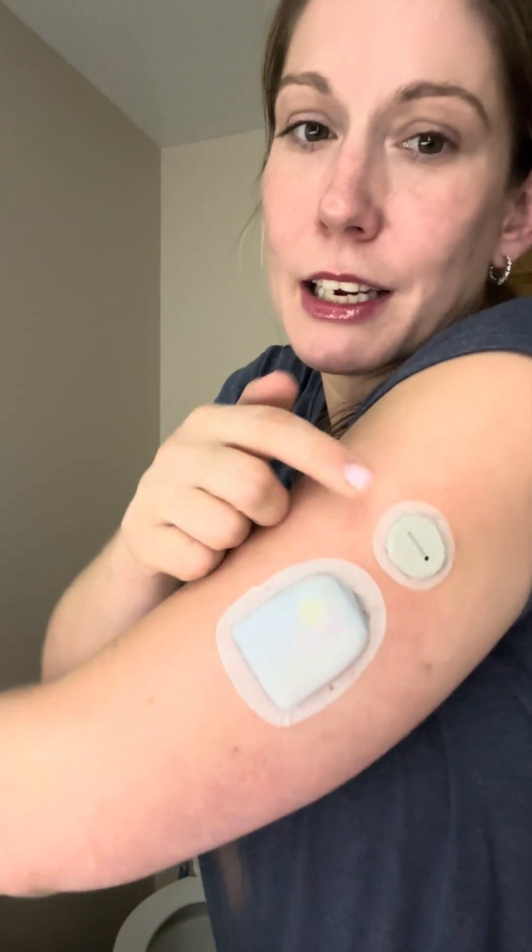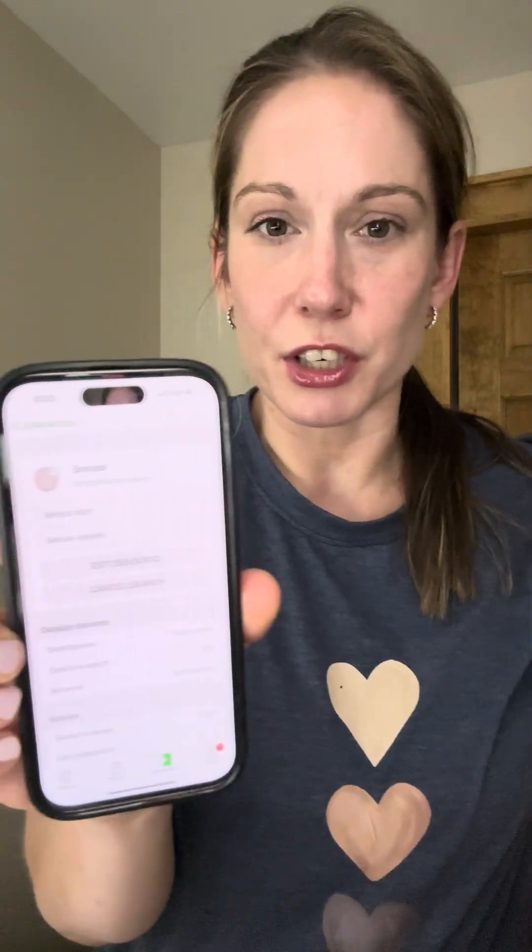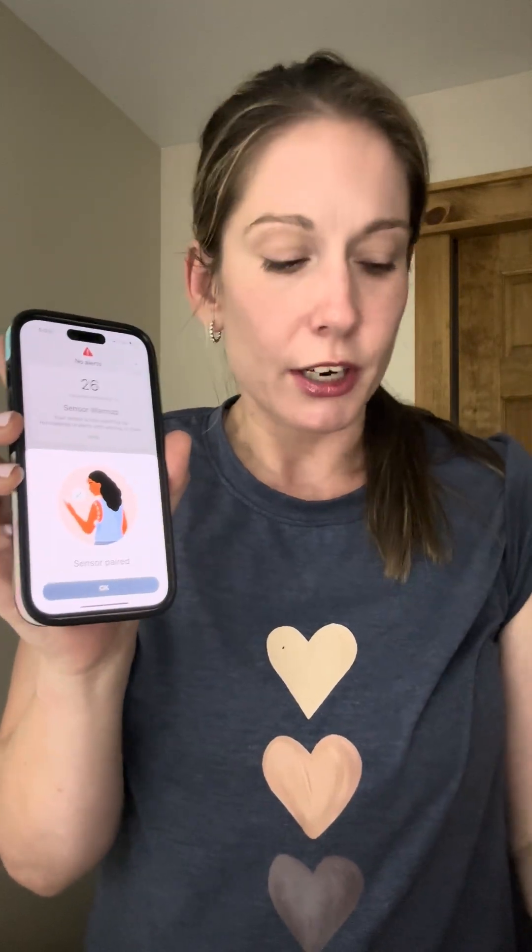Every sensor comes with an overlay patch — I have my husband do this for me every time because he's just very good at it. When I try to put them on I don't get it right and it ends up falling off, plus it's on the back of my arm so it's kind of hard. You can see how the sensor looks next to the pod. I'm going to click that my sensor is inserted. It's now searching for the sensor and asking if I want to pair it via Bluetooth with my phone — I want to pair that so my Dexcom app will communicate with my sensor. My sensor is paired and will be warmed up in 26 minutes. That's another huge pro of the G7 — only a 30-minute warm-up period; the G6 was longer.